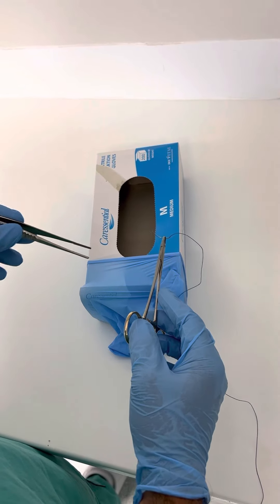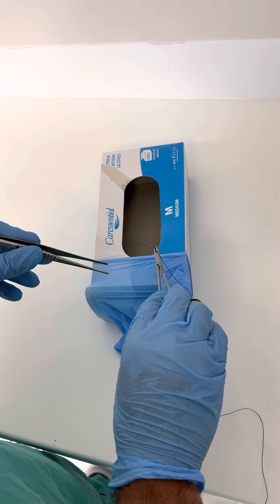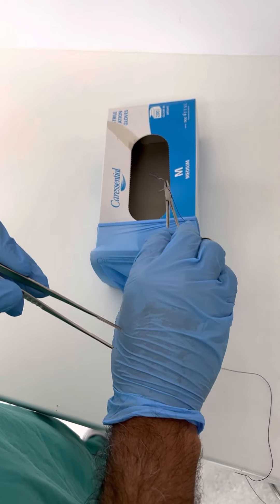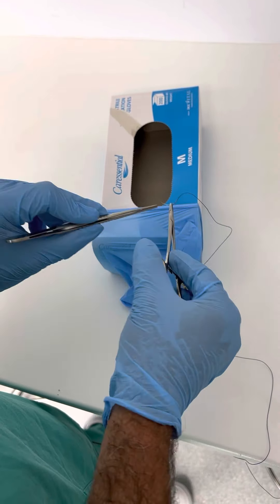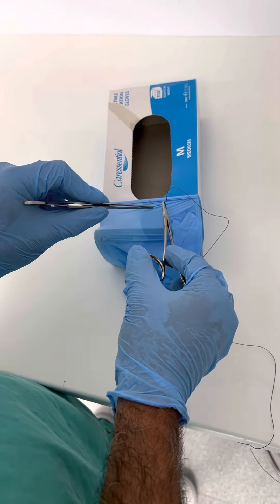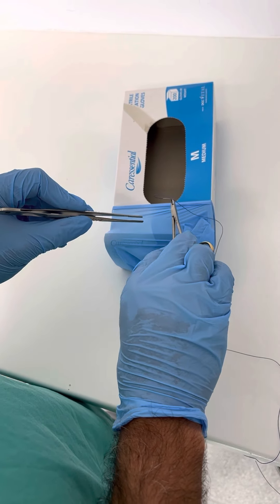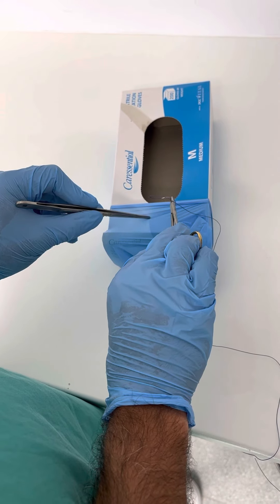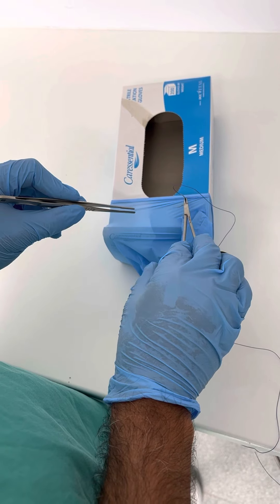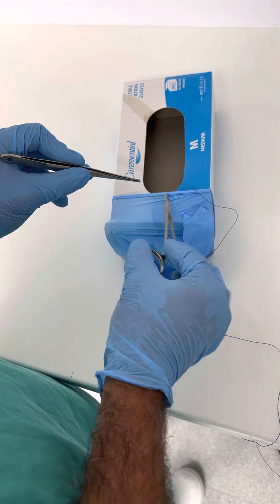I'm going to come here and take my first bite. Notice that my wrist is rotating. You need to think about the shape of this needle and how it's going to glide through the tissue. If I want to take deep bites of tissue, I need to go more of a right angle. If I want to take a superficial one, I go less of an angle — you can see how by going more tangential, you take a thinner bite of the tissue.